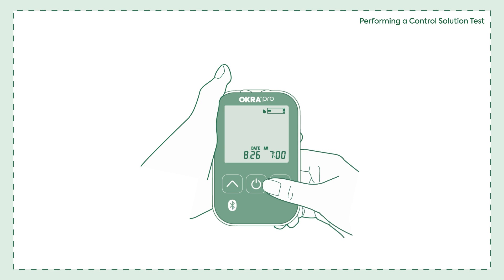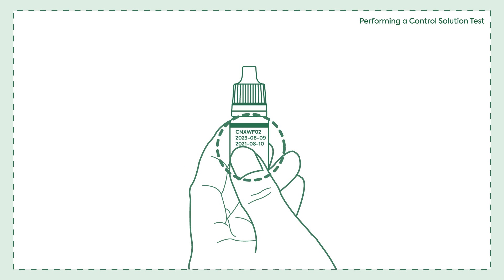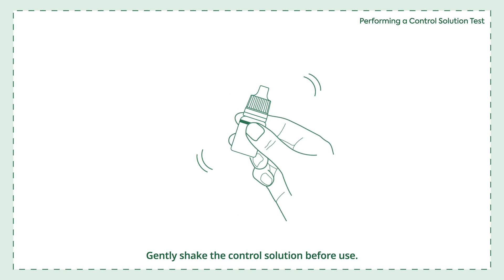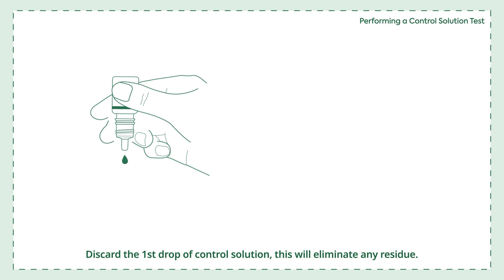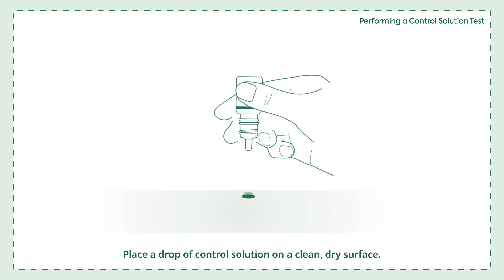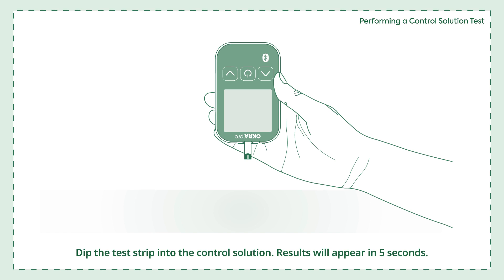Press and release either the up or down button. The control solution bottle icon will appear, then press the power button. Check the expiration date before performing a control solution test and make sure the control solution is not expired. Gently shake the control solution before use. Discard the first drop to eliminate any residue. Place a drop of control solution on a clean, dry surface and dip the test strip into it. Results will appear in 5 seconds. Compare the result to the range printed on the test strip vial — the result should fall within that range.